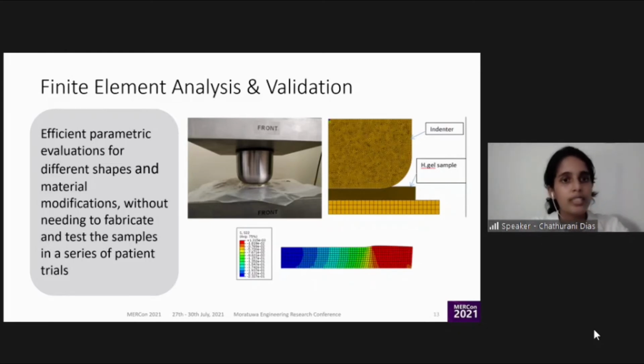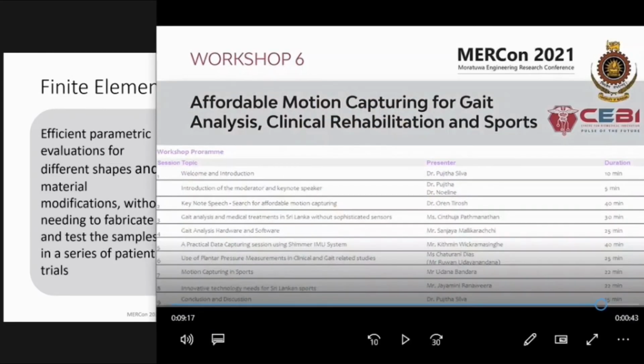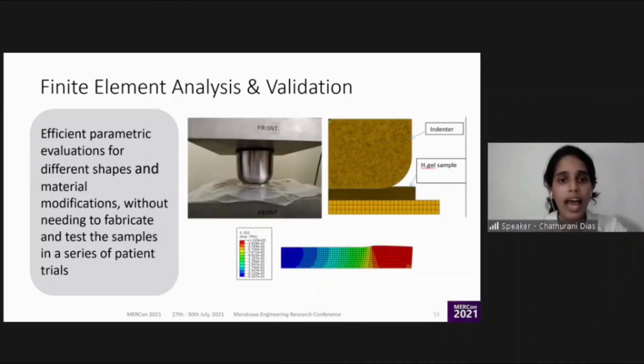In this finite element analysis model, the conditions that the material was subjected to were changed, and we tried to identify the optimal thickness that our offloading attachment should have. Once that was obtained through the modeling, we synthesized that material with those particular properties and thickness, and then went on to verify these results again with an interface pressure measurement test.